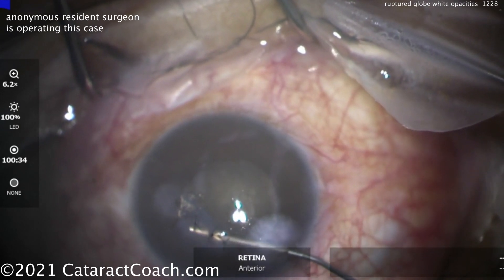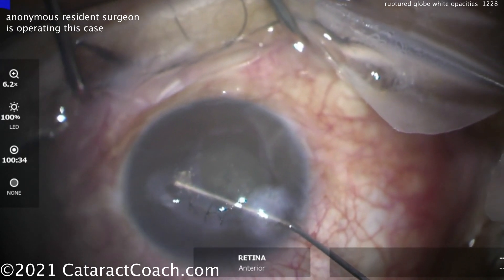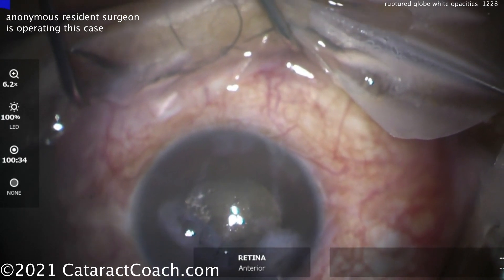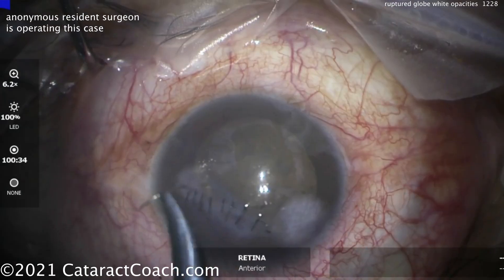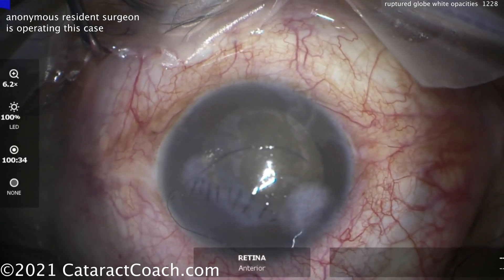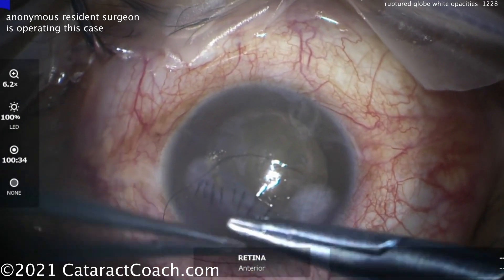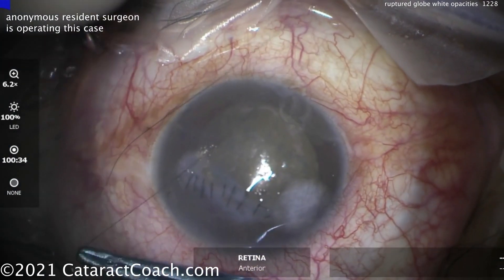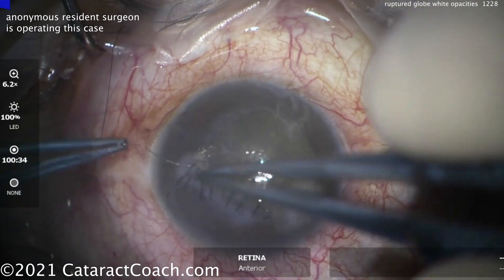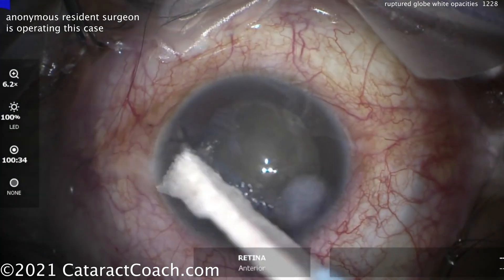There are articles and hand-drawn figures and diagrams to really explain it. Closing up this laceration and injecting more viscoelastic — you can see where it's leaking out from. It's going to take more sutures than you think. You may want to make the sutures a little on the longer side so they can span more of the laceration width — you'll probably end up with fewer sutures. If you make very tiny sutures, you'll need more of them; with longer sutures and more bite on either side, you'll need fewer.